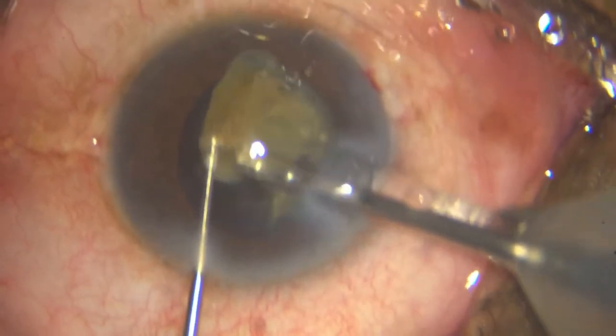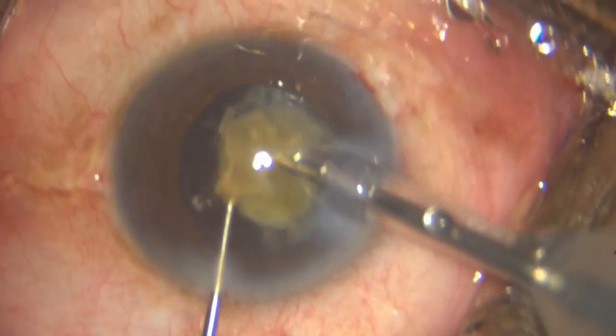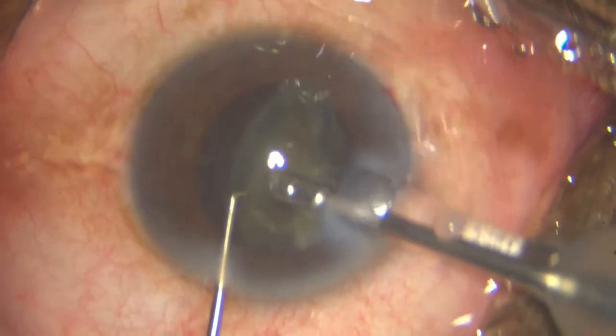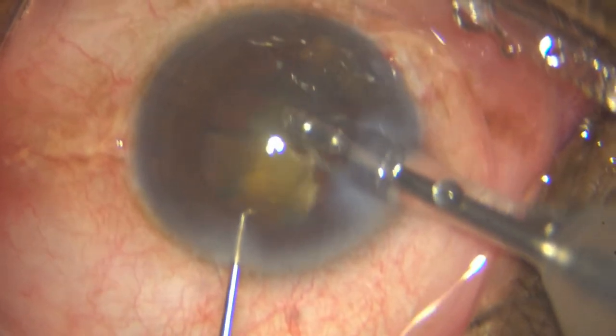Just trying my best to keep it at the iris plane or lower. The trick in all these hard cataracts is to FACO at as low a plane as possible. It's not about the FACO time, it's not about the FACO power — it's about staying away from the cornea.